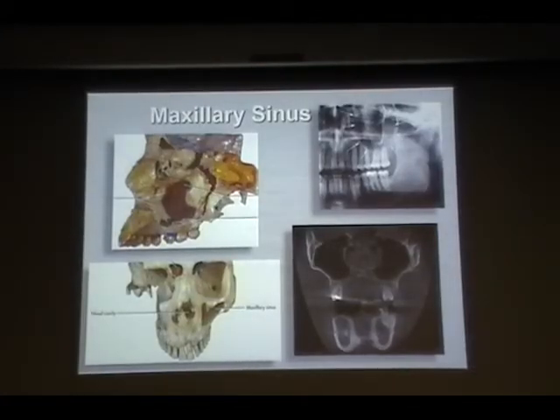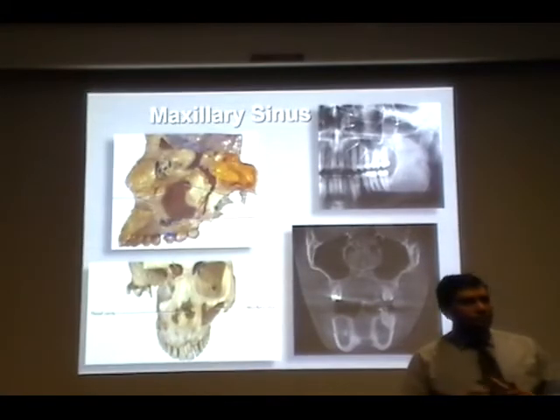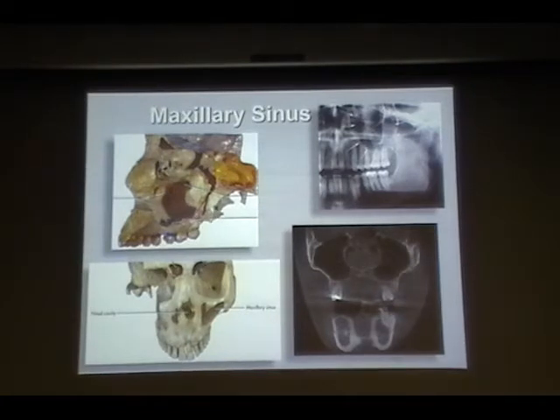So the maxillary sinus is air-filled. Unless there is some kind of disease process, it generally is radiolucent. When we use terminology for CT or CBCT, we use hypodense or hyperdense, like radiolucent, radiopaque, because we are dealing here with densities, not so much radiolucent or radiopaque.